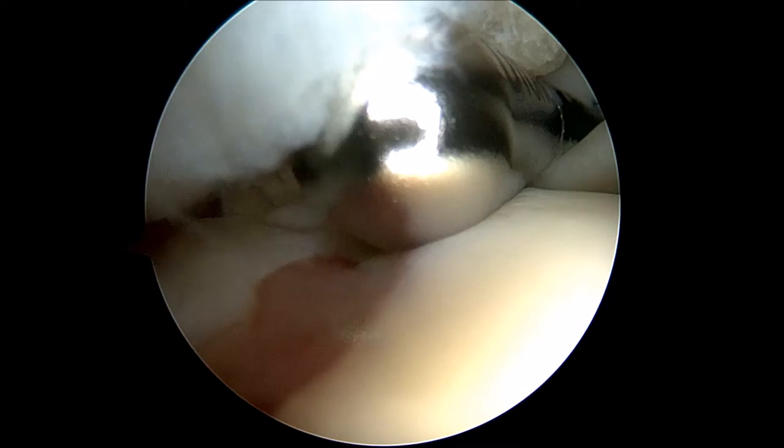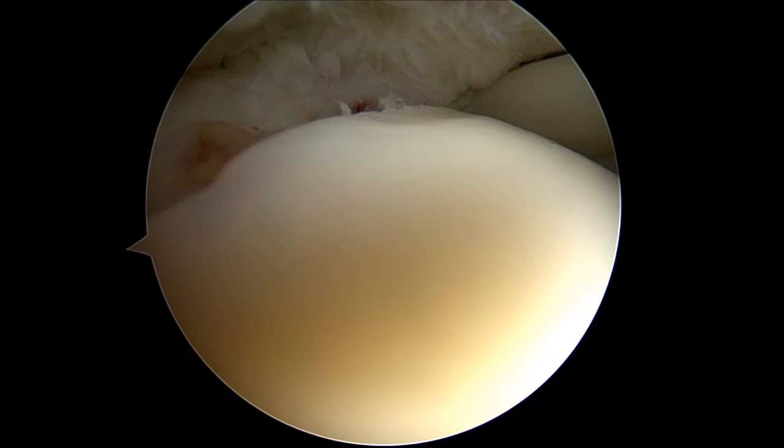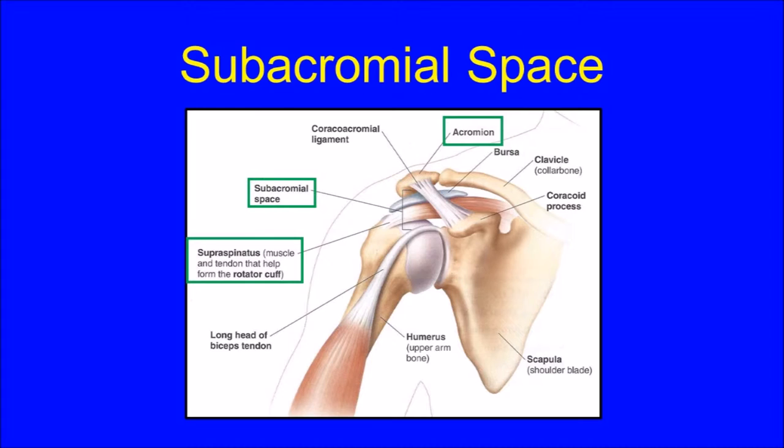After the frayed tissue has been removed, you can see the exposed rotator cuff footprint, which appears red in this image. This is the area of bone that the rotator cuff tendon should be attached to, but has torn off of. Next, the camera is moved into the second viewing space above the shoulder, known as the subacromial space. From this perspective, you can look down onto the top of the rotator cuff and up onto the overlying shoulder blade or acromion.